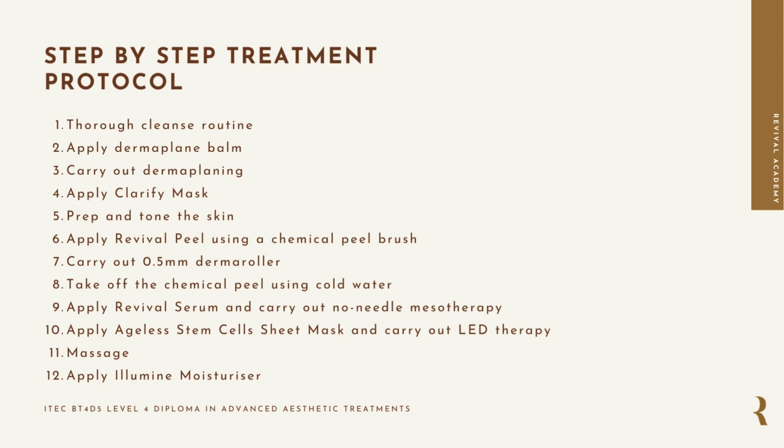Here you can see the full treatment protocol step by step, and we are going to go through each individual step in the video. We do advise you to follow the treatment routine strictly, as results can actually be compromised if the products, equipment or techniques are altered or not included in the protocol. Now let's have a look at the first step of the dermaplaning.